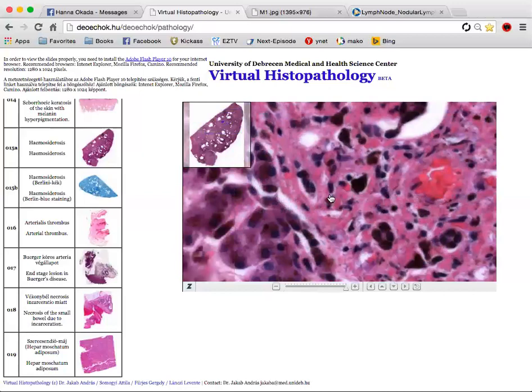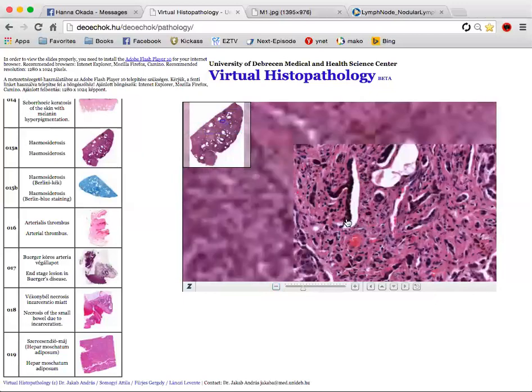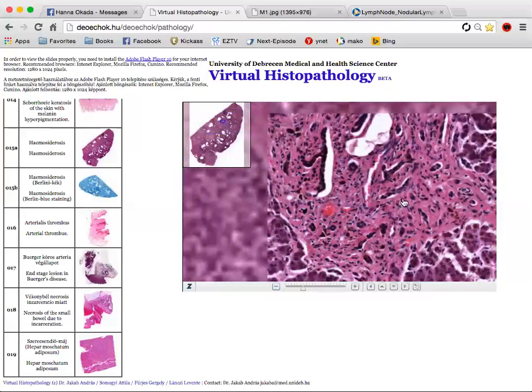Sorry, what do you want to ask? Like, this connective tissue is made by the inflammation or something? No, there's not a lot of inflammation here. It's just fibroblasts. Okay, so it's like normal? It's not normal. This is all pathological. So a liver should not look like this.